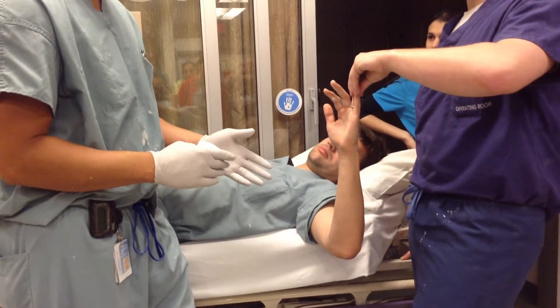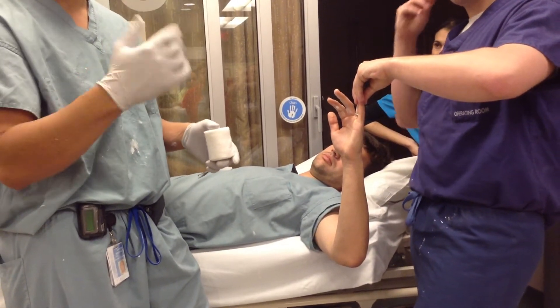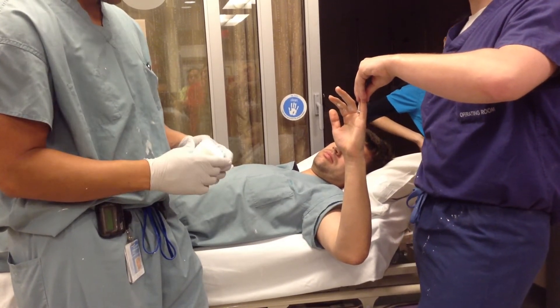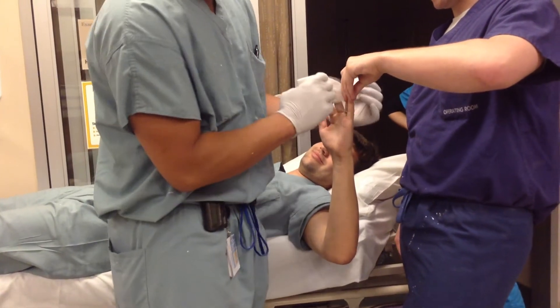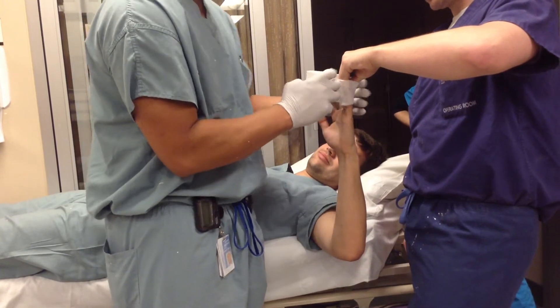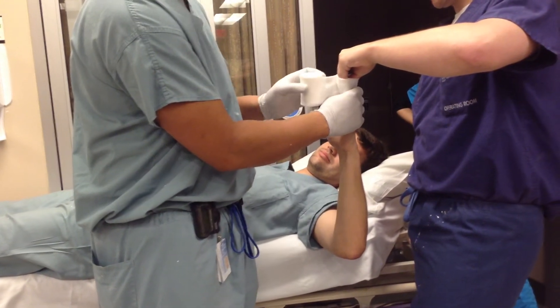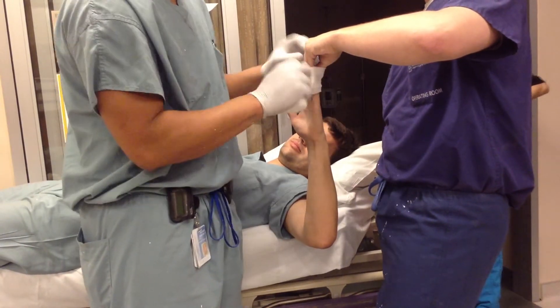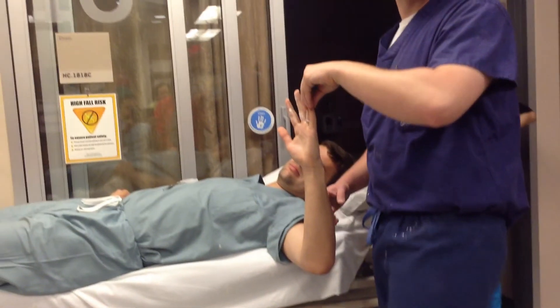I'm used to doing these sometimes for younger kids at Children's, when they're always non-compliant and they're going to be doing stuff they shouldn't. I make it a little bit longer — it just restricts them a little bit more. But for your average non-compliant adult, you can make it a little bit shorter. So start up here, and I'm wrapping around here. Nothing feels better than punching a wall when you get mad.